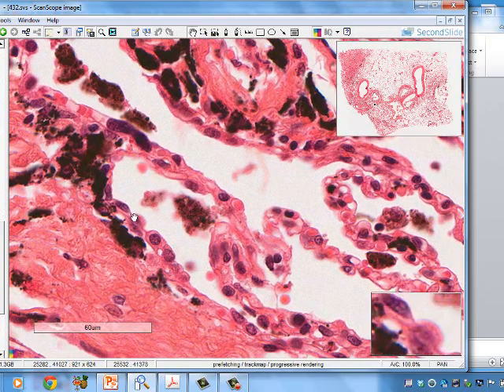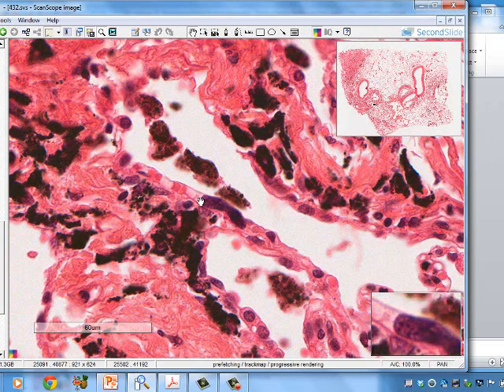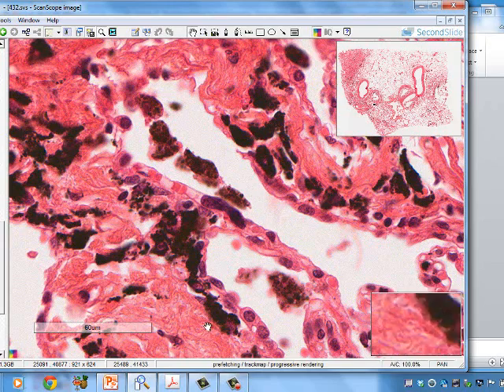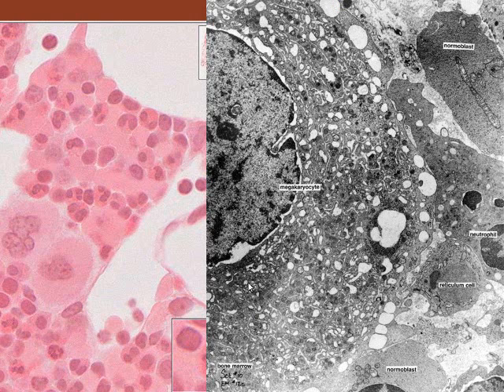Surfactant secreting cells in through here. So these are type 2 pneumocyte and type 1 pneumocyte. Connective tissue. You can see the endothelial cell, nucleus of red blood cells going through there, right adjacent to the airspace. And so we can see those. That's what we're seeing. Those macrophages in through there, which were given rise from the monocytes.